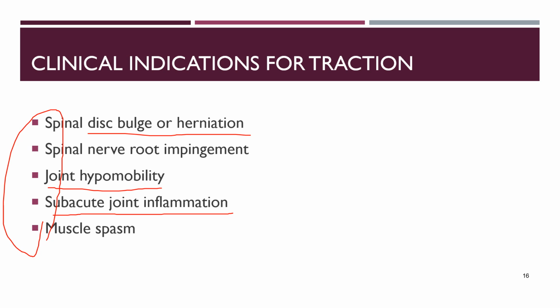Muscle weakness, sensory loss or sensory dysfunction, those things. And again, we can use our mechanical traction to help reduce muscle spasms by stimulating those GTOs, creating inhibition of those alpha motor neurons.